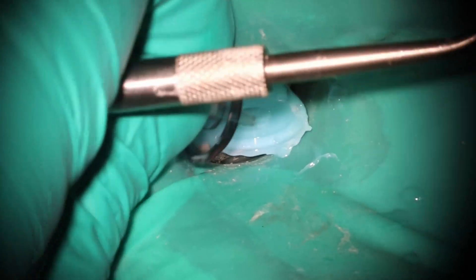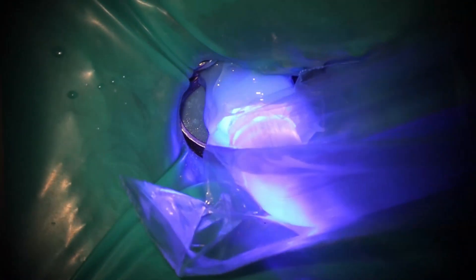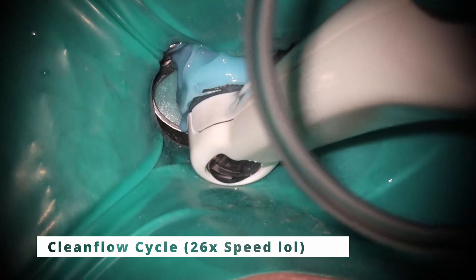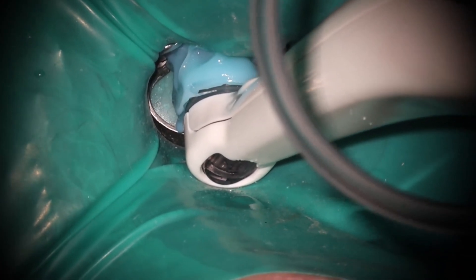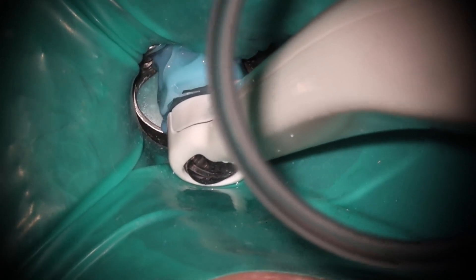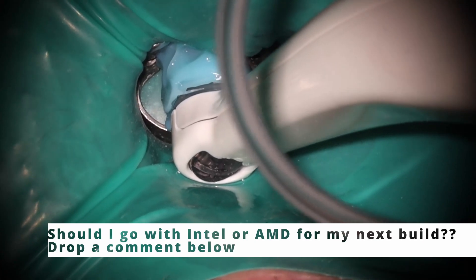Always cure after to make sure that the air-inhibited area is good. Then this is going to be 26 times speed running through the cycle here — there's not much to see because it's going so fast. My computer is struggling massively to get a video that actually looks good, so I'm interested to see what this final one looks like.